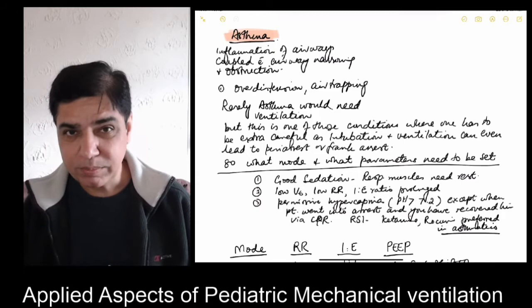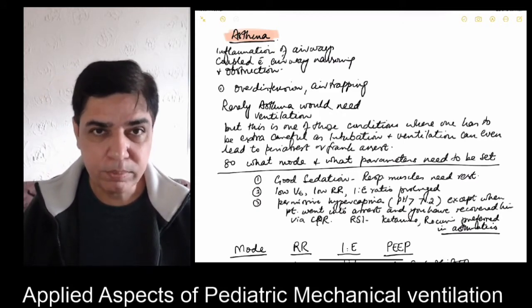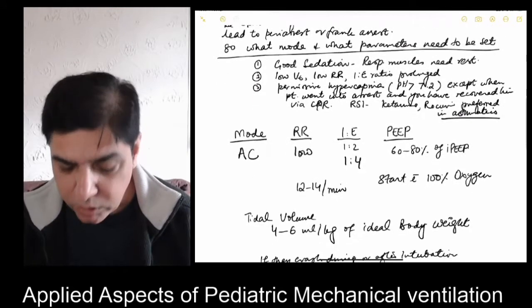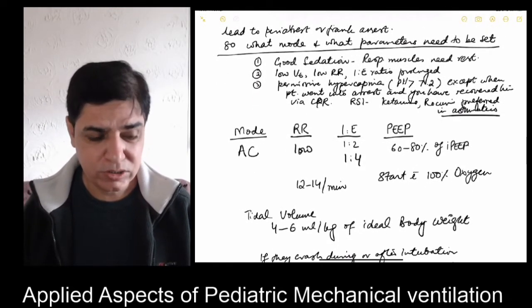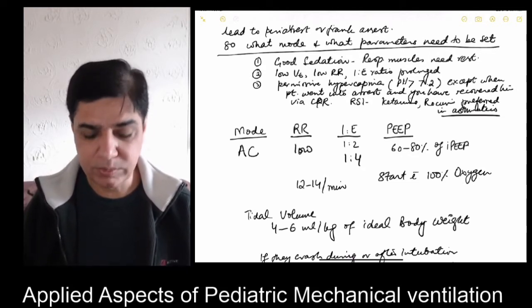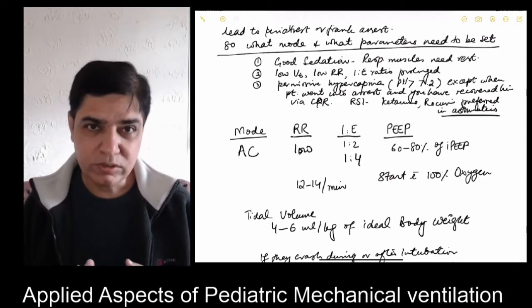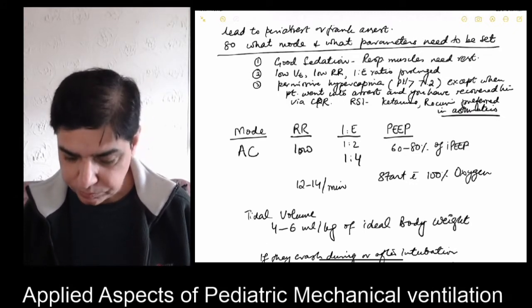We have seen that in many cases, sometimes in life-threatening conditions, while they are being intubated, they go into a peri-arrest situation or even frank cardiac arrest. So the question comes down to what mode we should use. For example, a child who has life-threatening asthma, you've tried all the medications, you even tried the IV bronchodilators, but still he's in respiratory failure. SATs are not picking up, acid-base disturbances are there. So the question is, you have intubated, what settings should you use?